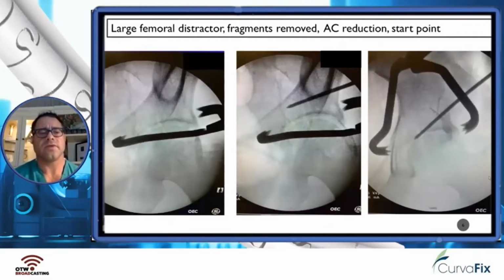The transverse fracture, as mentioned, was fairly well aligned, especially after those fragments came out of his joint and his hip was reduced. The anterior column component was additionally reduced and compressed. I like to get it as anatomic as possible and compress it and hold it until the fixation apparatus is into the column. So there's a standard sort of angle jaw through the sciatic notch and standard location, compressing the anterior column component of the fracture.